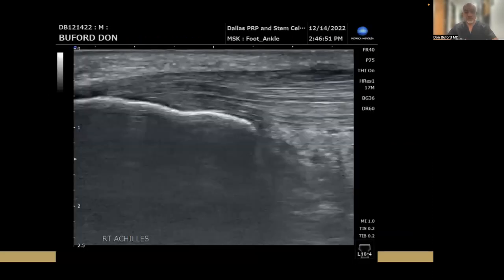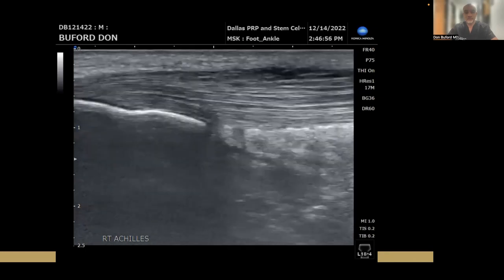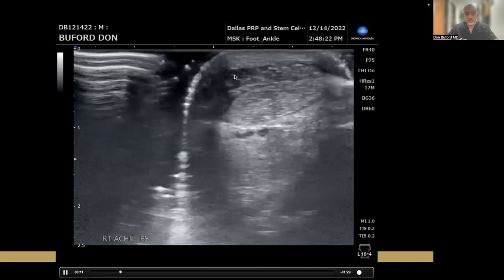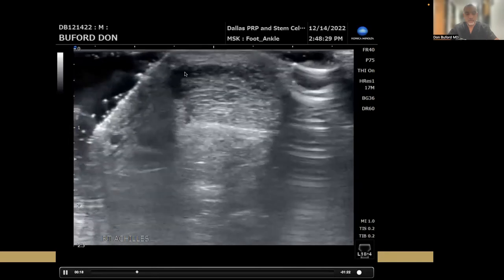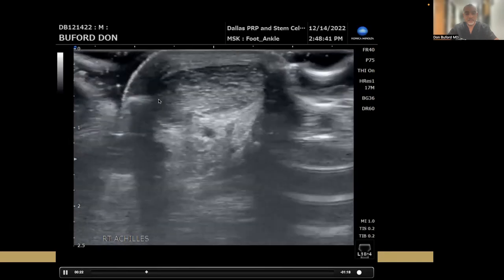This is the actual procedure, done on a Konica Minolta machine. This is the calcaneus here — this hyperechoic line is the calcaneus. This is the Achilles coming off of the calcaneus. The area of maximal pain is right in this region here, right in the middle of the screen. When we go into the short axis view, it's the left side of this Achilles tendon that's partially torn — specifically the medial side.